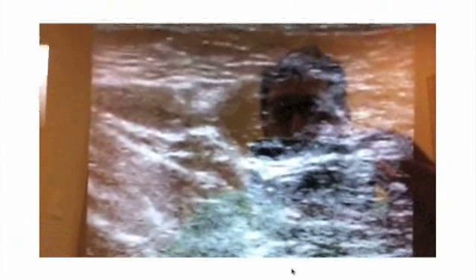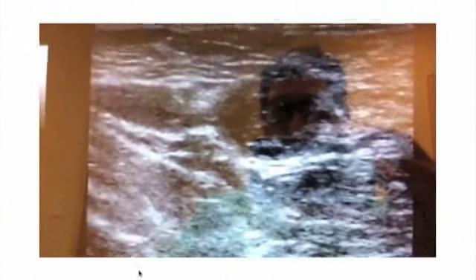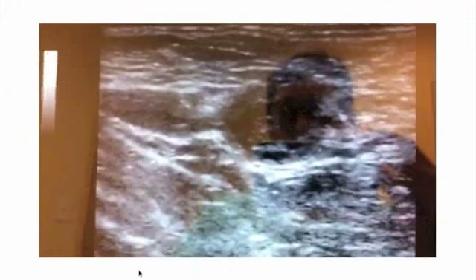So let's practice a little bit. Mike, what do you think? All right, we're compressing. Oh, actually, it looks like this is compressing, right? But it's pulsating. What's going on here? I'm guessing you're compressing so much that you're compressing the artery, and that vein is not compressing because there's a big clot in it. There looks like there's some sort of schmutz in the center of that vein. Yeah, exactly. So if you're compressing so much that your artery starts to compress, you don't have to keep pushing to try to compress that vein. That's enough. There's a clot in there.